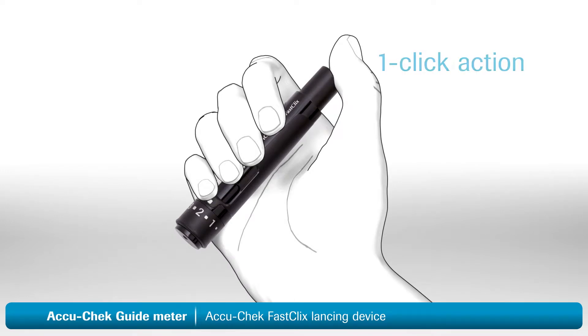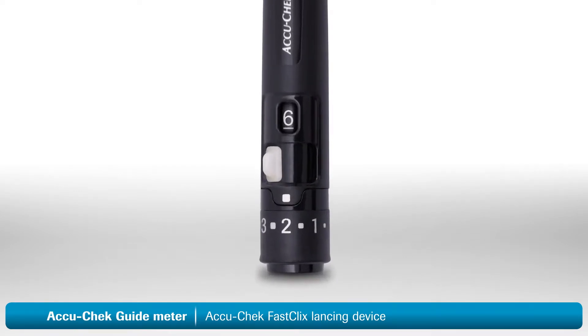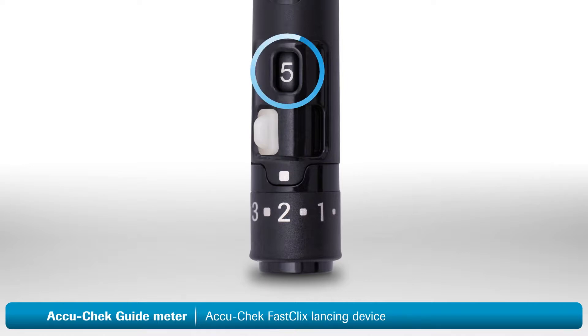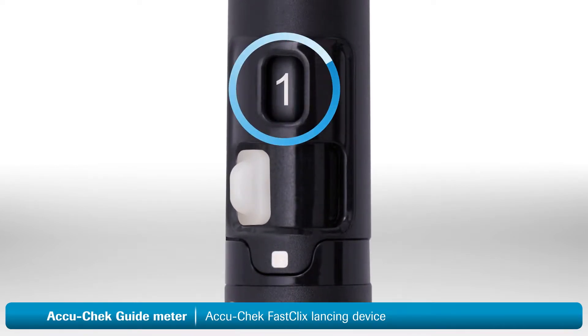The AccuCheck FastClicks lancing device has one-click action. To use it, simply press the release button all the way down — this will lance your finger. After each test, you will need to advance to a fresh lancet. To advance to a new lancet, simply push the white lever back and forth once. The new lancet is now ready to use. You'll notice that the number in the window has decreased by one, which tells you the number of lancets remaining. When the number shown is one, you're using the last lancet. After using it, you need to change the lancet drum.